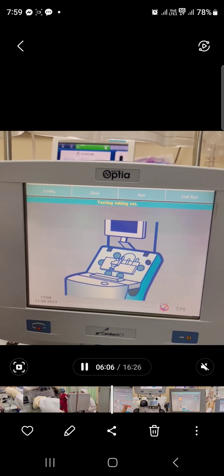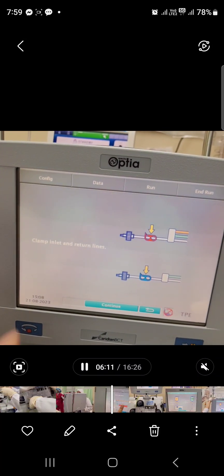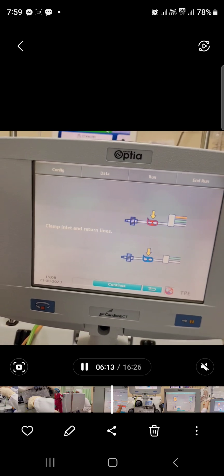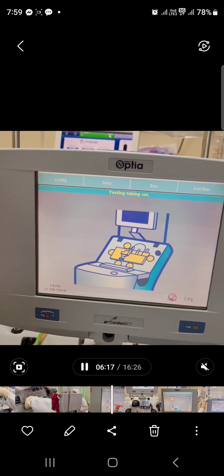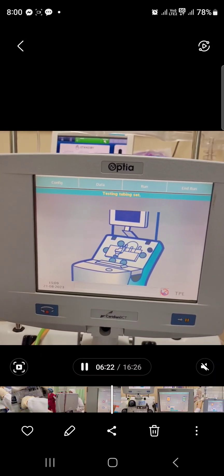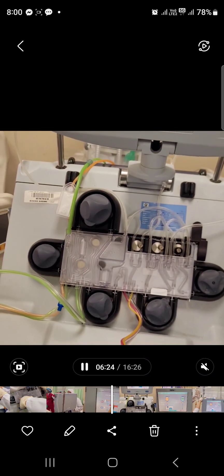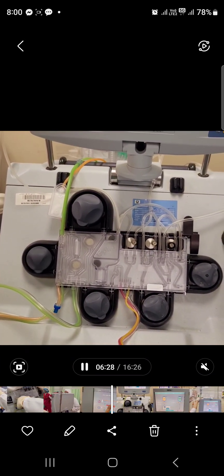The machine is now testing the tubing set. It is instructing to clamp the inlet line — clamp both red and yellow, then blue and red. Press continue. The machine is really testing the tubings to ensure that all tubings are set up correctly.